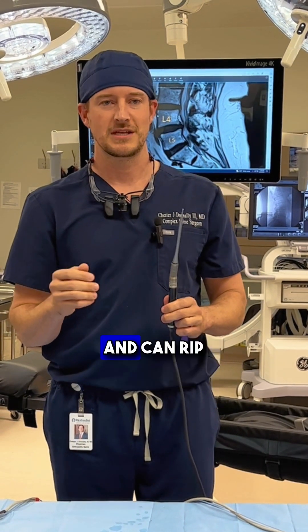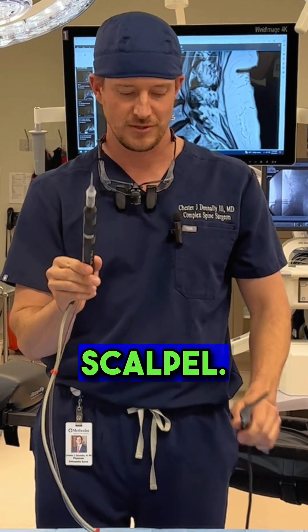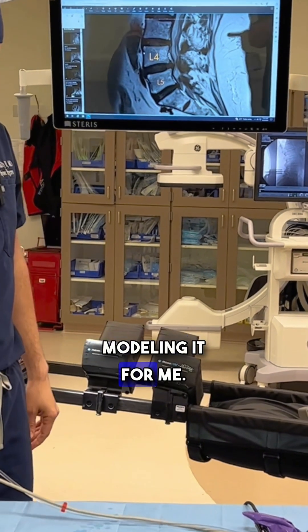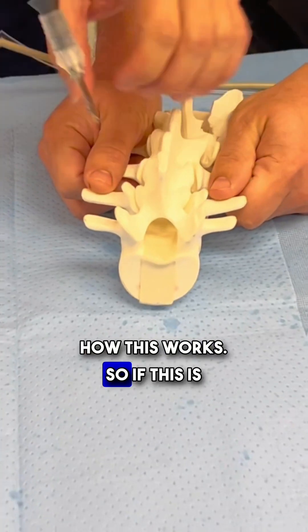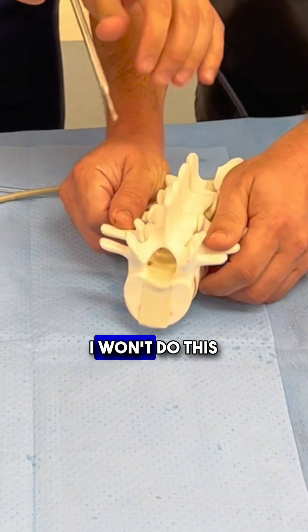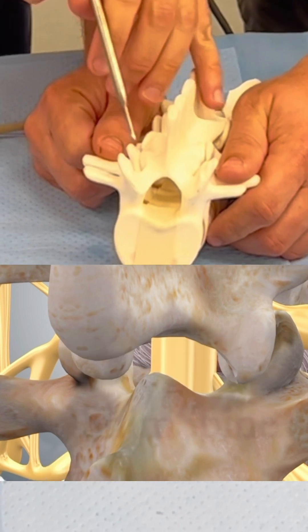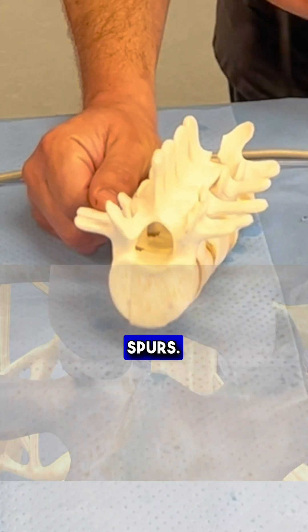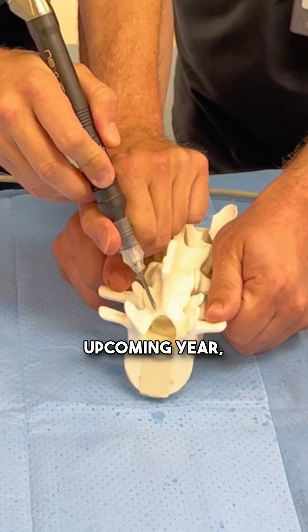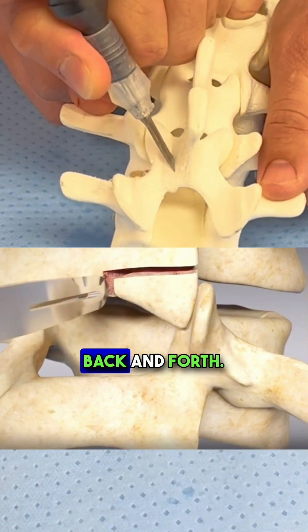That burr will definitely pop balloons and can rip dura. That's one of the many nice advantages of something like this, the ultrasonic bone scalpel. I have a spine model over here with one of my models who will be modeling it for me. Let me show you how this works. Traditionally, surgeons might use a burr, but I use the bone scalpel down here around the bones — that's a great way to remove some of the bone spurs. This newer technology makes these small cuts, going back and forth.